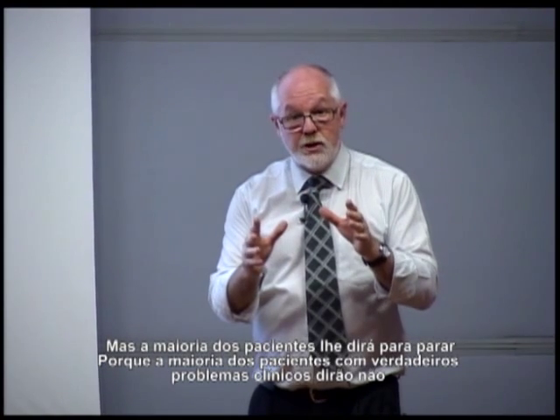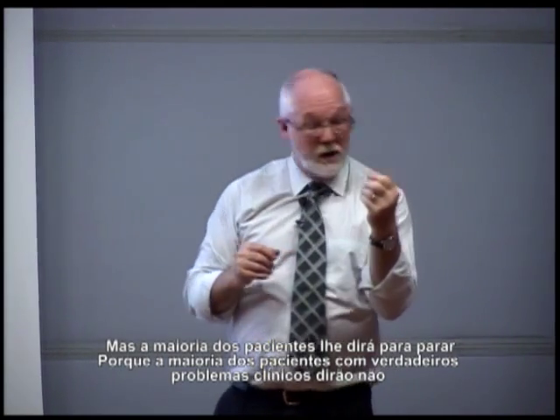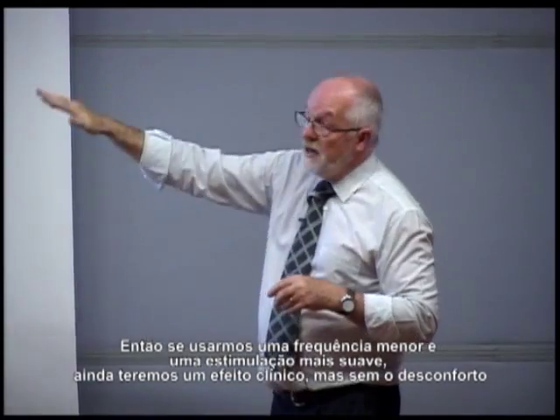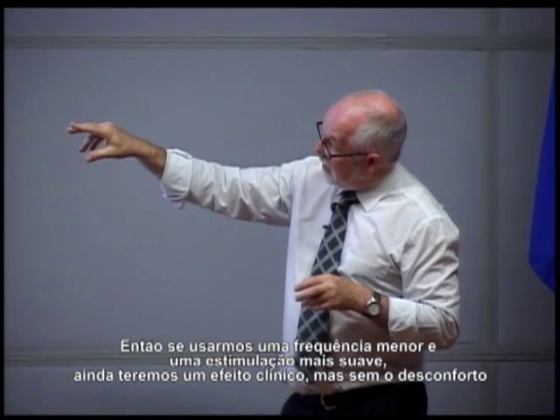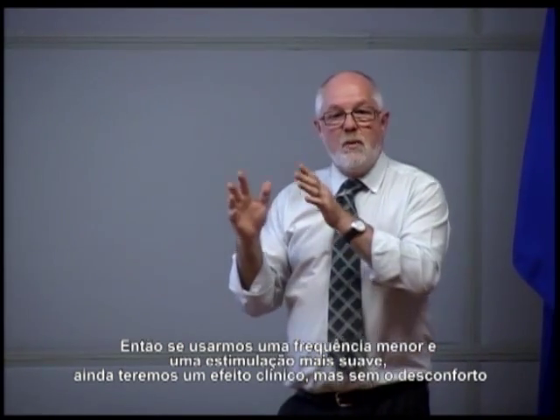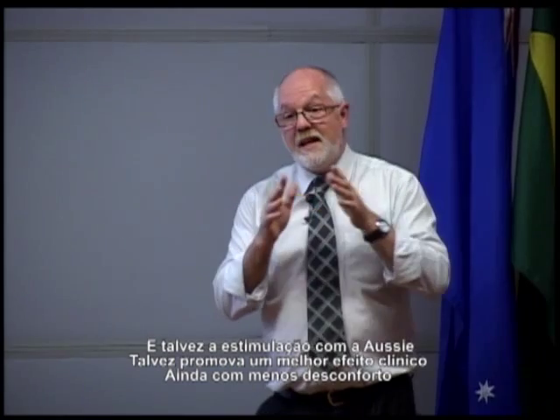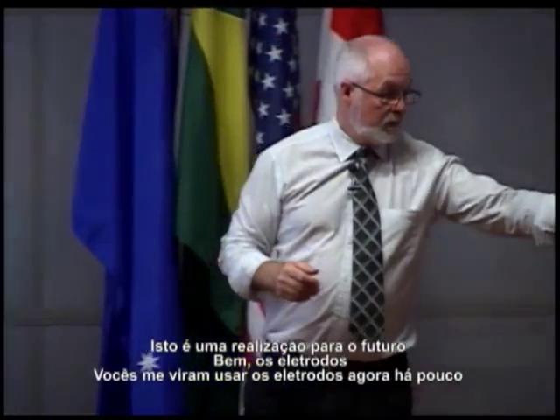But most patients will tell you to stop, because most patients with a real clinical problem will say no, ow, that hurts, it's horrible, stop. All right? So if we use lower frequency, and if we use a more gentle stimulation, we still have clinical effect, but without the discomfort. And it may be that the Aussie stim maybe gives us even more clinical effect with even less discomfort. So that's the way to go for the future. Okay.